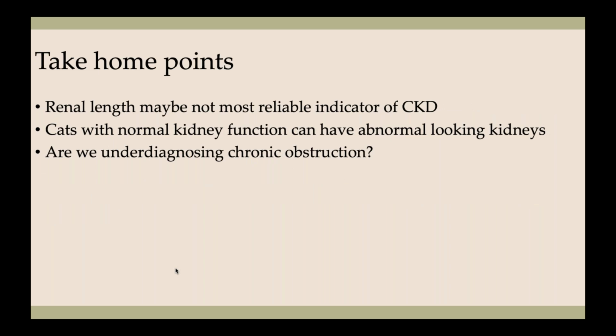So my take-home points are that length might not be as reliable as cortical thickness for CKD. Cats with normal kidney function often have abnormal looking kidneys. I care about the function more than I care about how they look, but certainly that's good information to have.